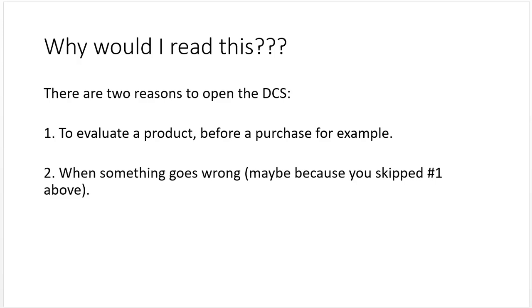Why would I read this? There are two reasons to open the DCS. One, to evaluate a product before a purchase. And two, when something goes wrong. Sometimes other departments will purchase a DICOM device without consulting you, and so you didn't have a chance to read the DICOM conformance statement. So when they ask you to connect it to PACS, that's the perfect time to say, can I see the DICOM conformance statement for that product you bought?